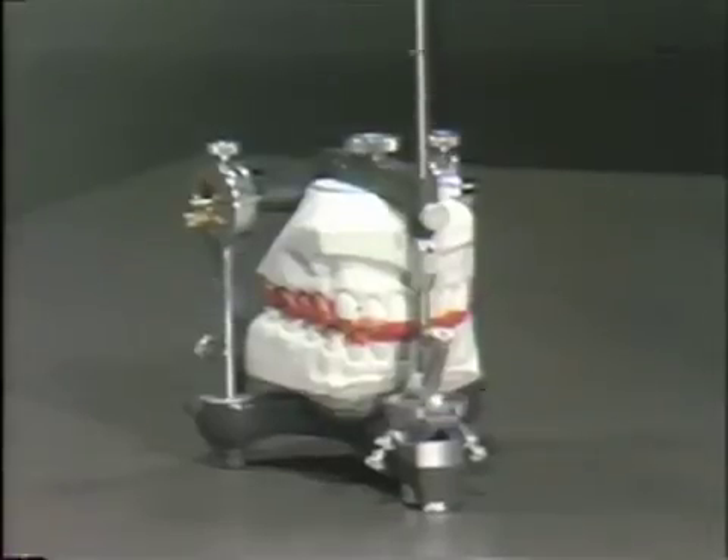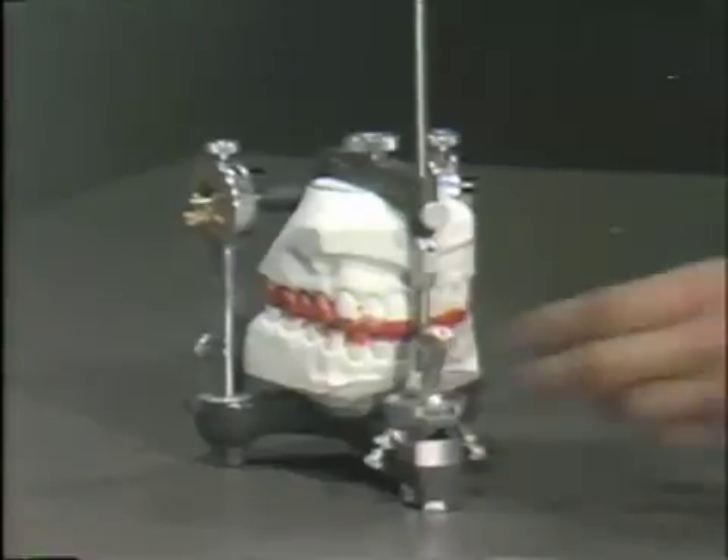As with any step in occlusal adjustment, prior to the adjustment in lateral, a careful occlusal analysis should be performed. On this particular set of casts, one side has been fabricated to have a cuspid guidance, the other side has been fabricated to have occlusal interferences that would prohibit a lateral excursion.